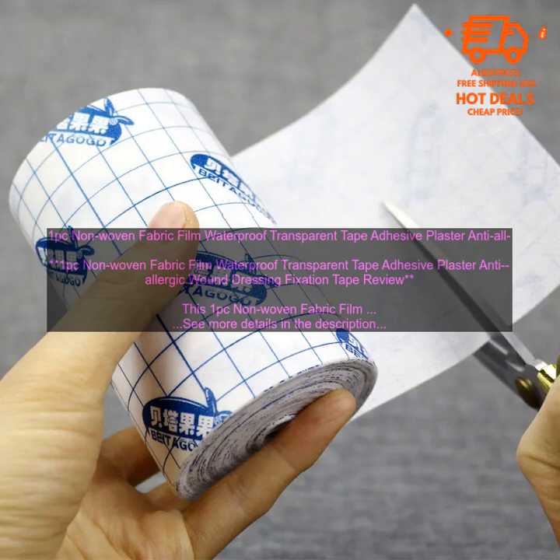Here are some tips for using this tape: clean the wound thoroughly before applying the tape, cut the tape to the desired size, apply the tape to the wound making sure that it is secure, and change the tape as needed.